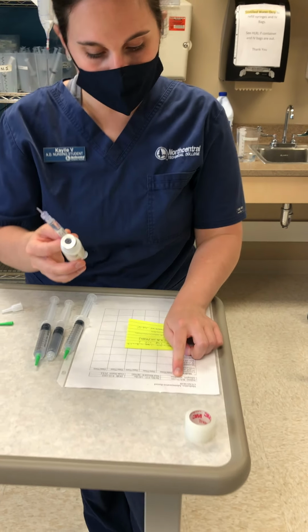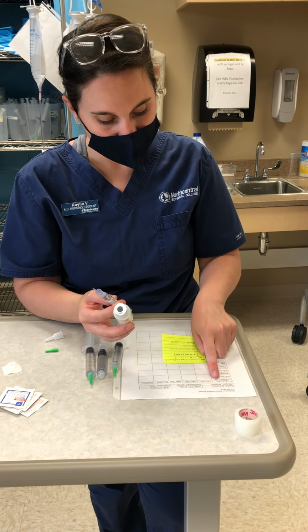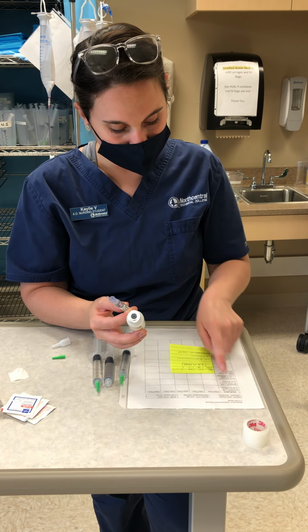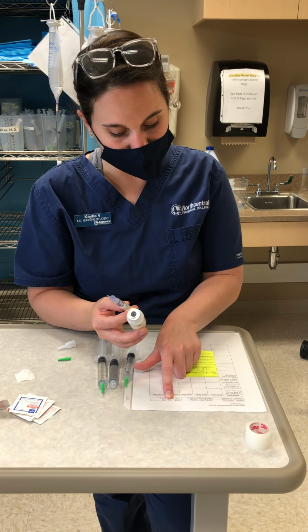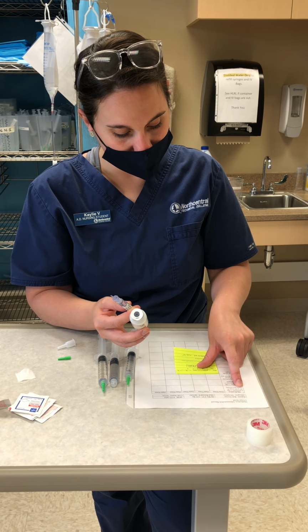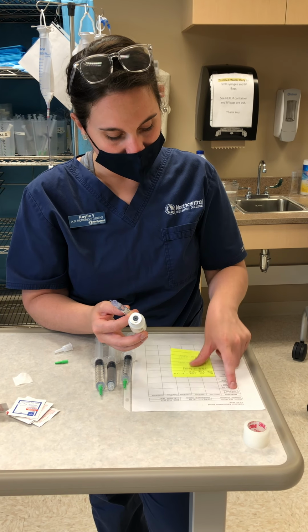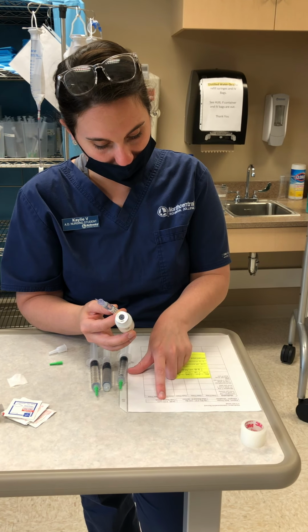Okay, patient Bob Owens, date of birth 9/22/33, medication lorazepam, 1 milligram, which comes out to be 1.5 mLs. He's to receive it every 3 hours for anxiety via IV push. I have Bob Owens, 9/22/33. Medication is lorazepam, 1 milligram via IV push, which is a 1.5 ml dose every 3 hours, and it is due now.